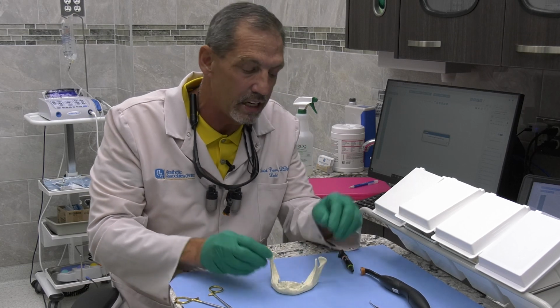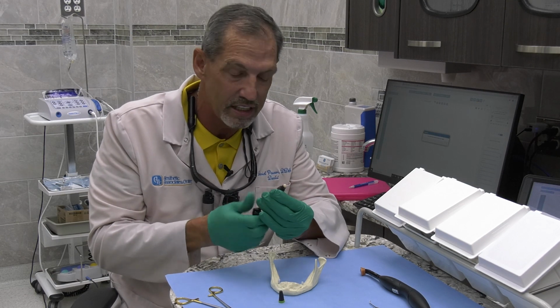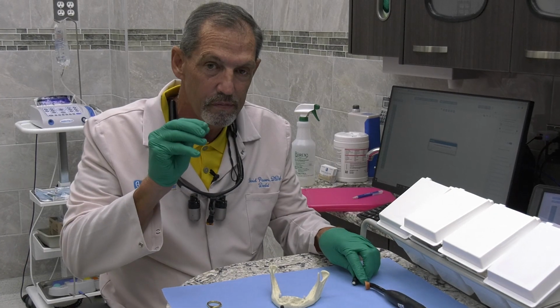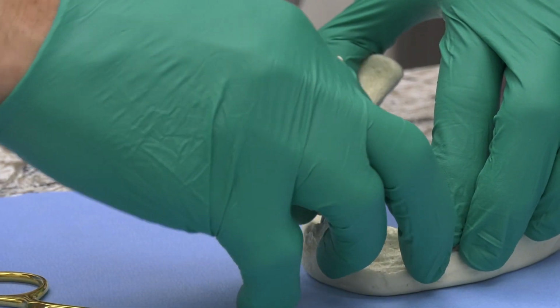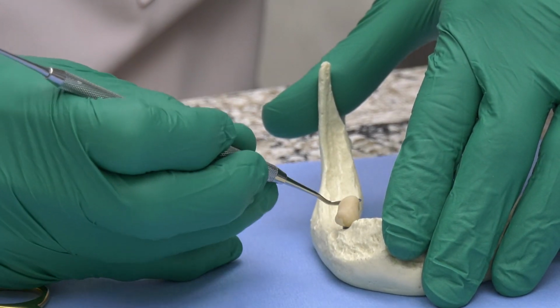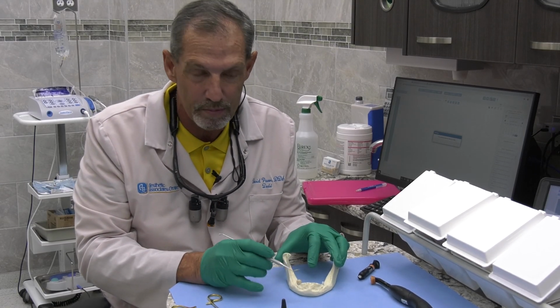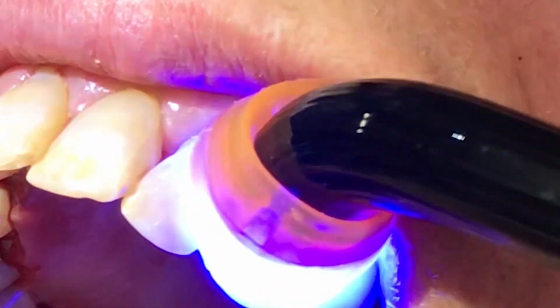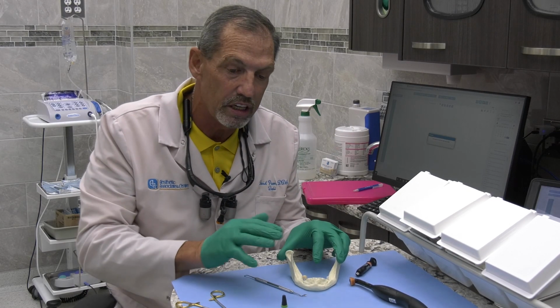Once they're snapped into place, we can take a composite resin of your choice. The way I do it is I roll it into a ball and place it right over the top of the implant healing cap, and push it into the undercuts of the adjacent teeth. Then I'll shape it up with my flat or plastic instrument. Then I'll have the patient bite down to get the occlusion correct. Then I'll light cure it, and after that, I'll shape it to look like the tooth and adjust the bite.